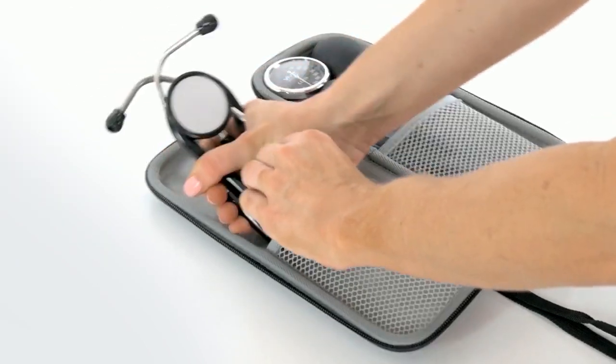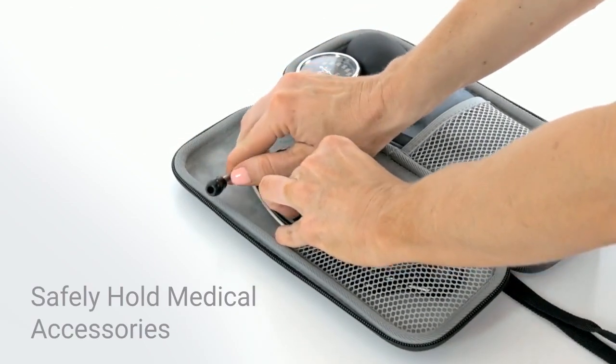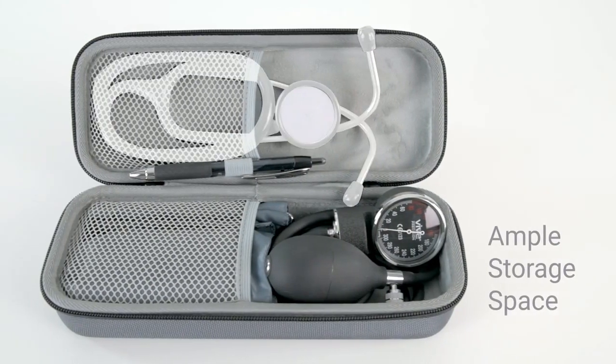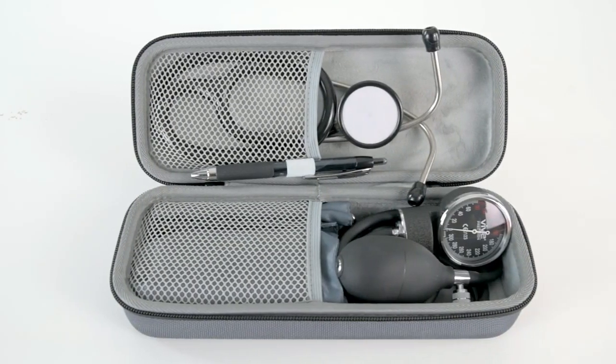The stethoscope case by Vive Precision safely holds your cardiology and nursing accessories. Easily store or transport a stethoscope, sphygmomanometer, and penlight.